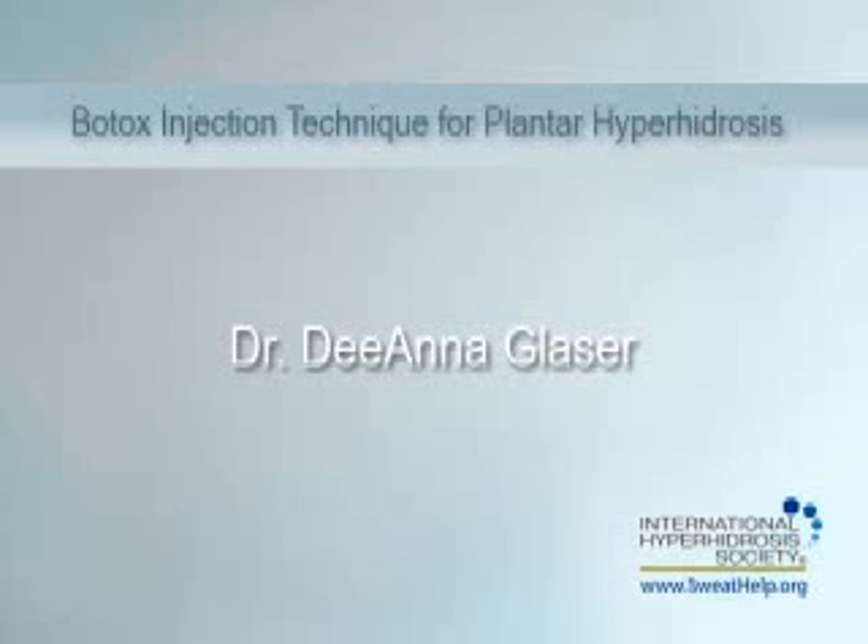On behalf of the International Hyperhidrosis Society, Dr. Deanna Glaser will demonstrate the Botox injection technique for plantar hyperhidrosis.